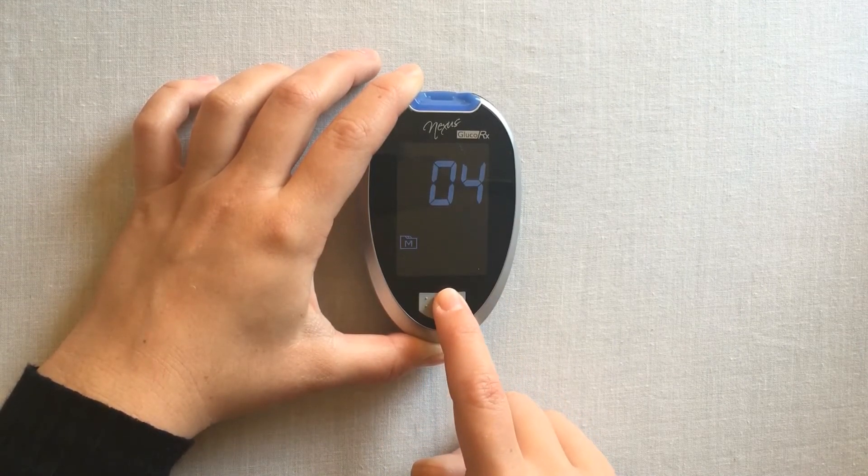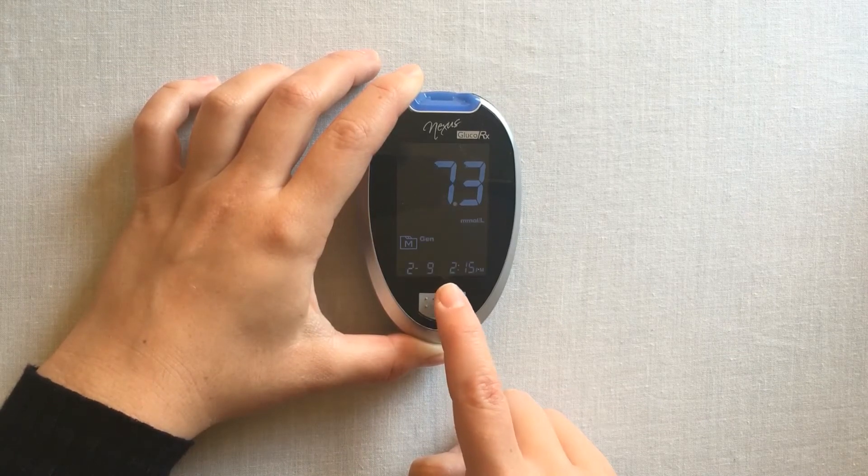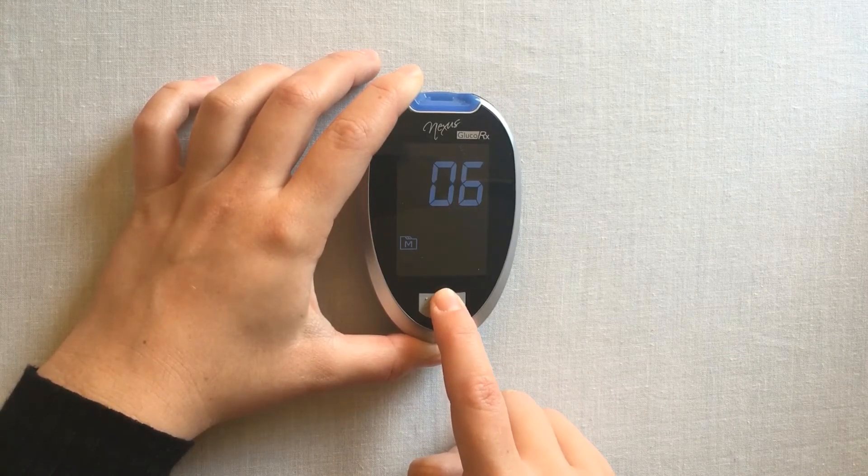Your meter will hold 1000 readings. Once full, the meter will operate a rolling memory function, deleting the oldest results from the memory.